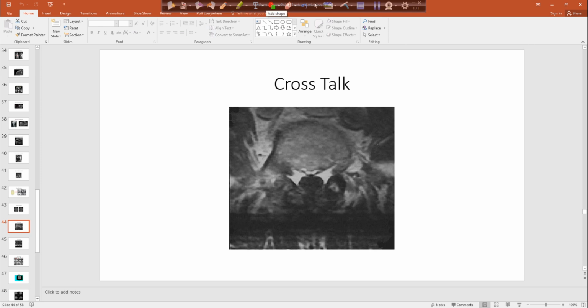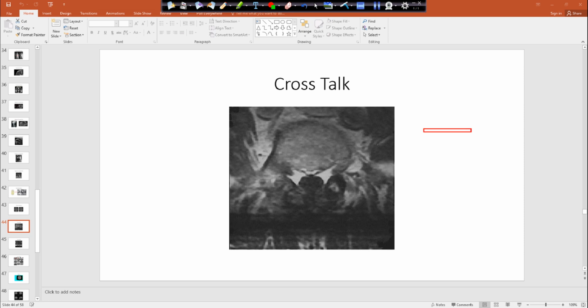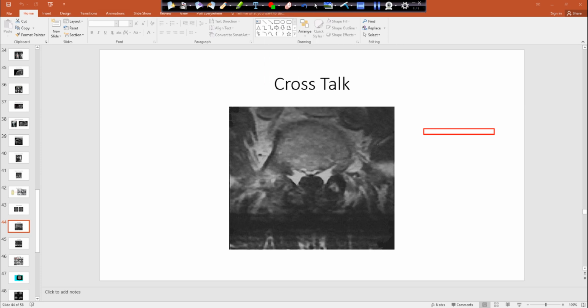So if you have two slices overlapping in some fashion, I guess I can angle my slices here. So if they're like this, and then remember our spine typically with something like this on a sagittal.